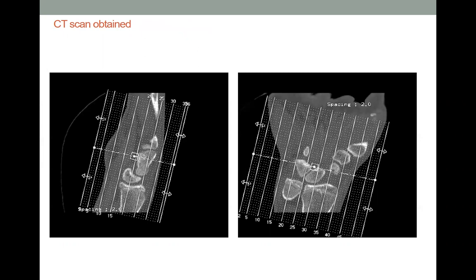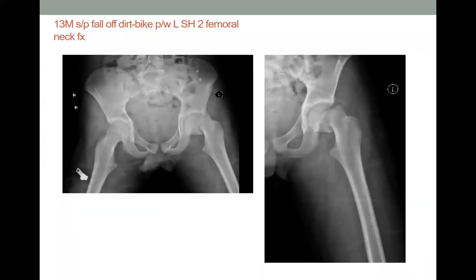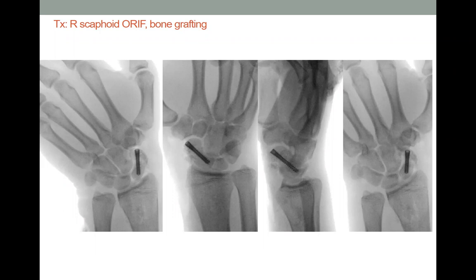Well, the main finding is sclerosis, which you don't have. Everyone gets some cystification as a normal process, but the main finding is sclerosis. So if you don't have sclerosis, particularly in this fracture pattern and location in this age group, if you immobilized it, it might heal. But nobody's going to tolerate 3 months of that. Because it's delayed, and some literature says if it's delayed 3 weeks or longer, the length of time to immobilize it would be exorbitant, and so people will fix this.